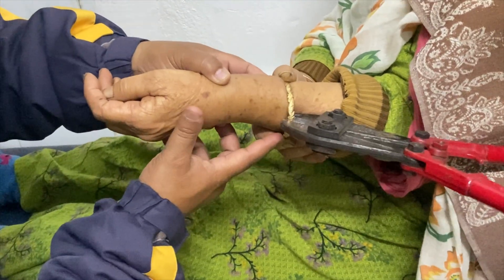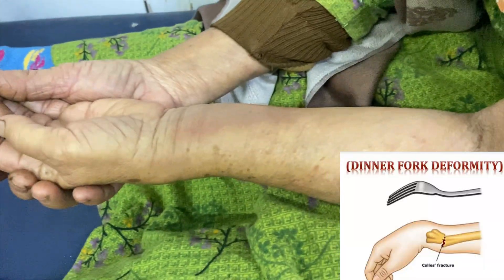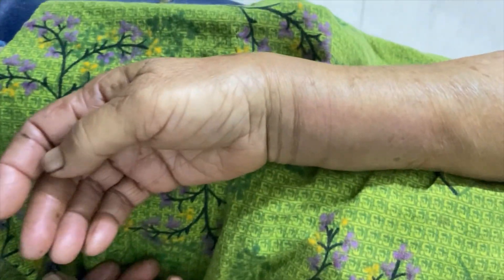Before starting manipulation, remove all bangles and rings. If difficult to remove, just cut them. Clinically it looks like a dinner fork deformity. Our plan is to manipulate — we will show you how to manipulate properly.